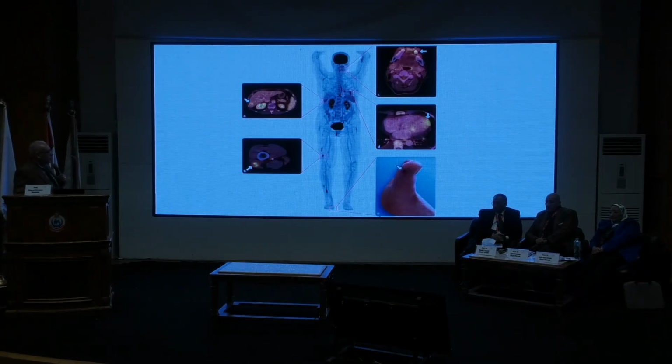Here is an example of how we will see the septic emboli uptake in the dental uptake, and here liver and skin and soft tissue emboli, septic emboli, appear as foci of increased uptake.